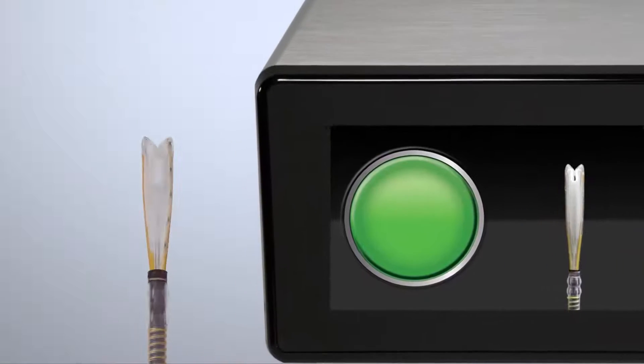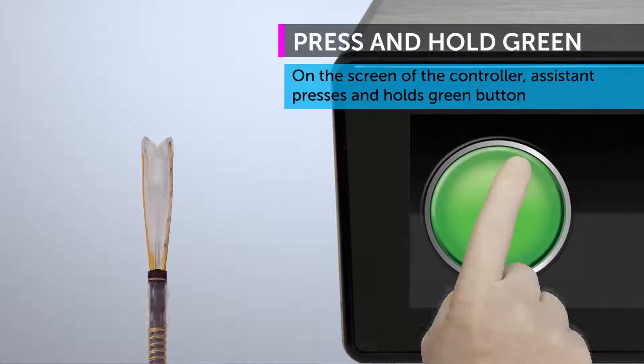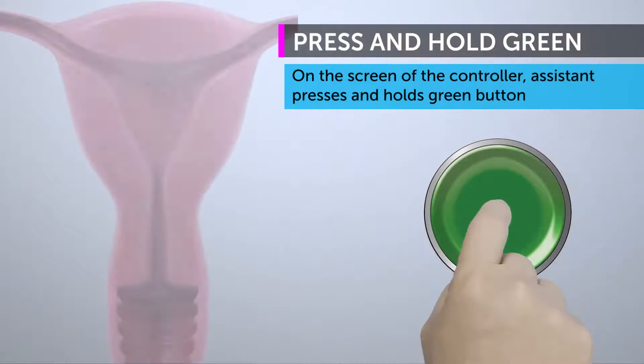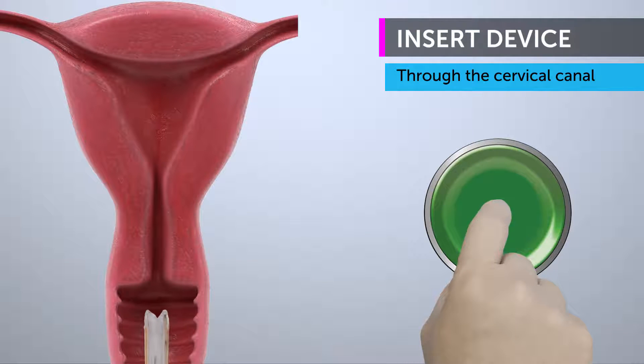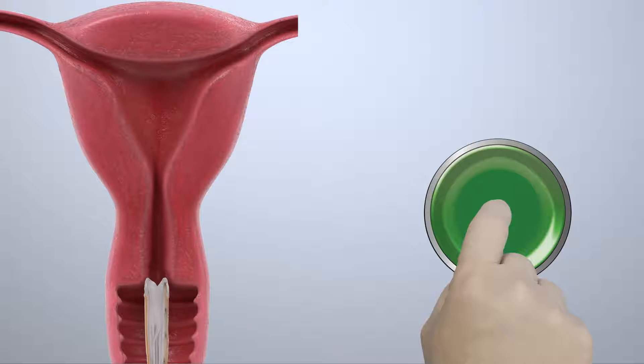The assistant should press and hold the green button on the controller to minimize the insertion profile of the array and continue to hold the green button during insertion. Insert the array through the cervical canal.